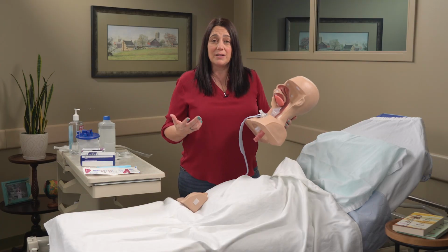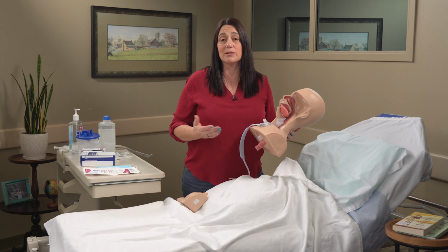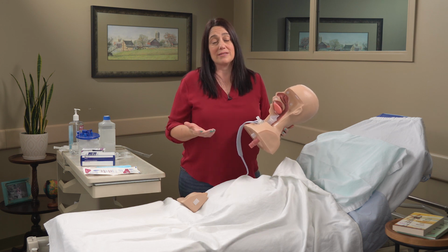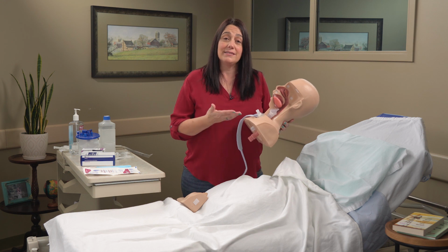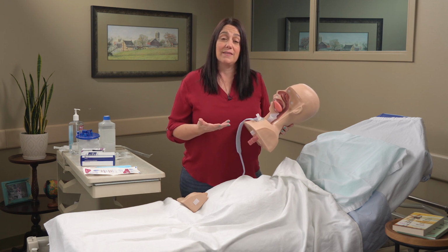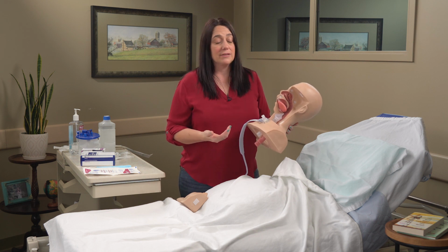And that's something that sometimes caretakers, it can bother them. But really, the only thing we need to do is if that person has that building up, we just need to tell them to cough and expel that mucus out. They can't help it. It's happening because their airway dislikes that device being placed in there. They don't have any control over it. And we just need to help them get it out.